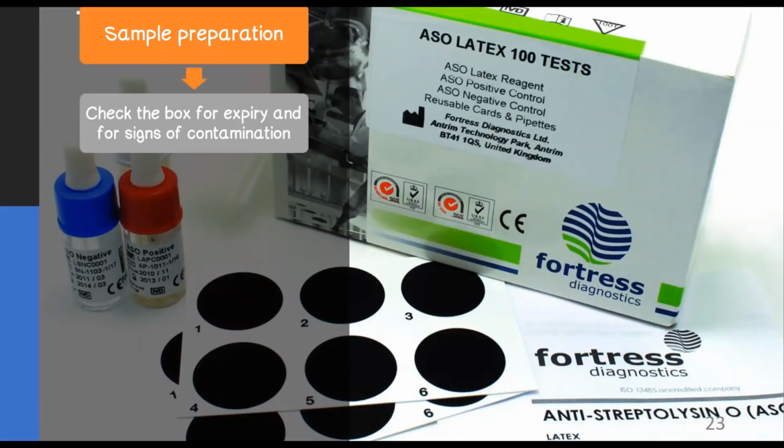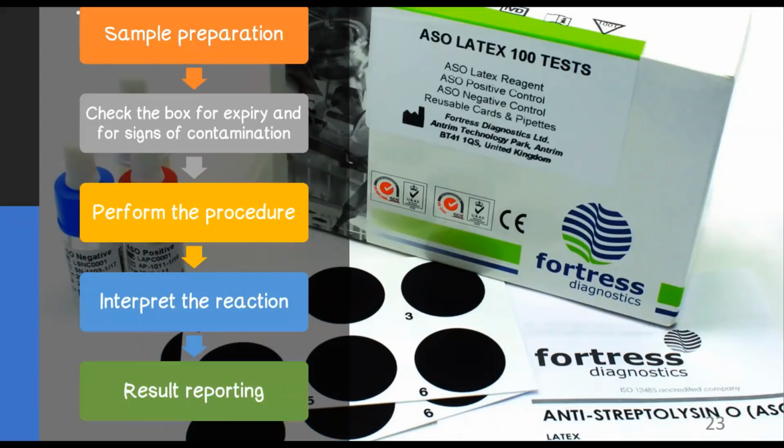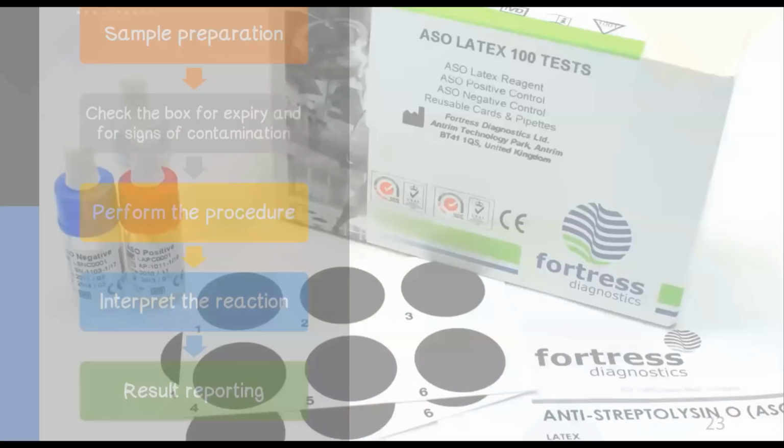If you see that the reagent is expired, of course you will replace it and get a new box of reagent. If you see that the reagent is contaminated, of course you will also replace it. You cannot use a reagent with contamination because contamination can cause either false positive or false negative reactions. After checking the box, perform the procedure, which we're going to detail in a little while, and interpret the reaction, and after which, report the result.